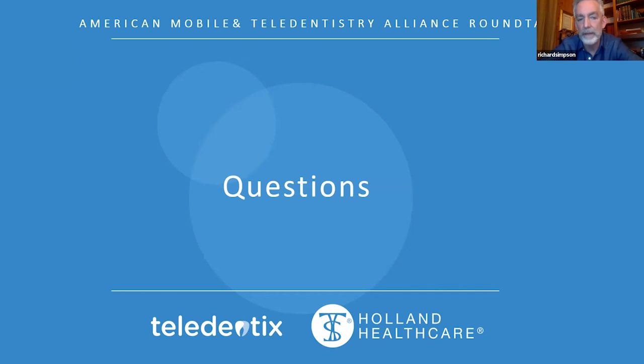Now, in thinking in terms of things that Sonia deals with, and some of the other people that are dealing with special needs patients, or elderly that aren't making their own healthcare decisions, with the Teledentix app and the TelScope, you can capture the image and bring their healthcare decision makers in on a video call, whether it's their adult children or a sibling, and conference with them about what your findings and recommendations are, even if they may be an hour away in another city.